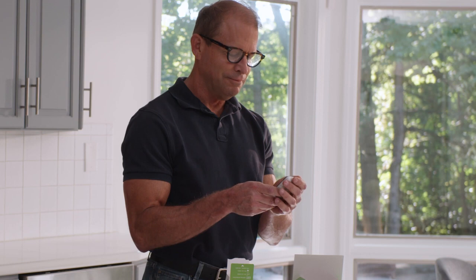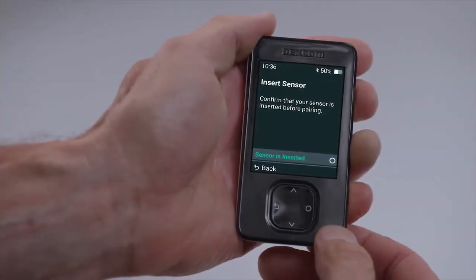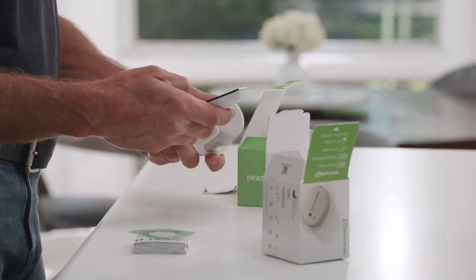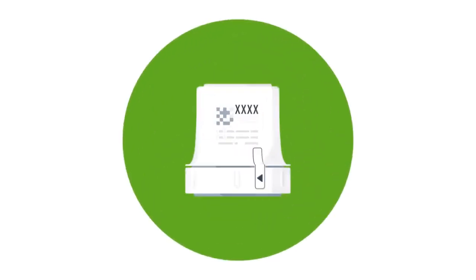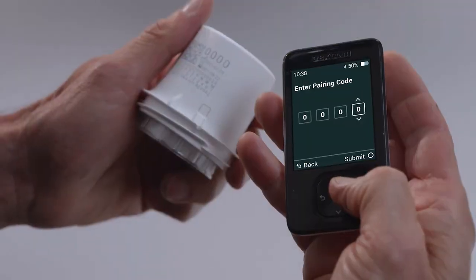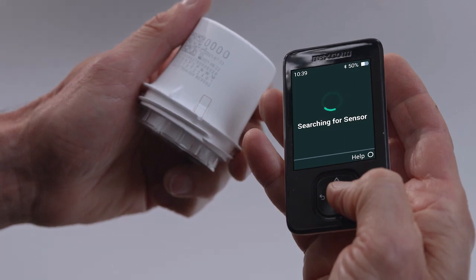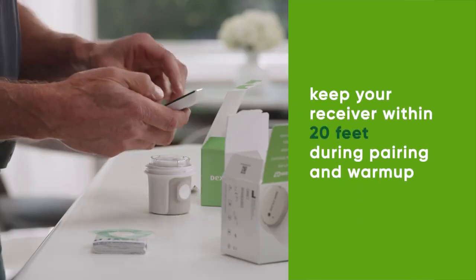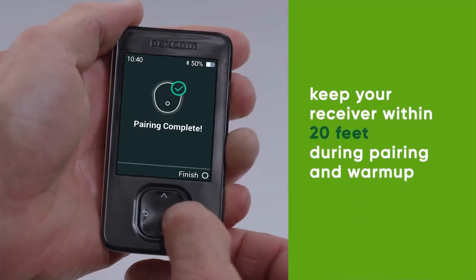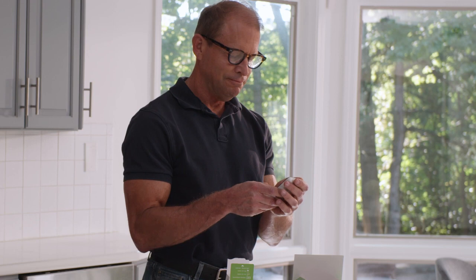After learning all about your new G7 system, you will need to confirm your sensor is inserted. You will then enter the pairing code. You will find the four-digit pairing code on the applicator you used to insert the sensor. Wait for your sensor to pair. Once pairing is complete, select Finish and you will enter into your sensor warm-up.